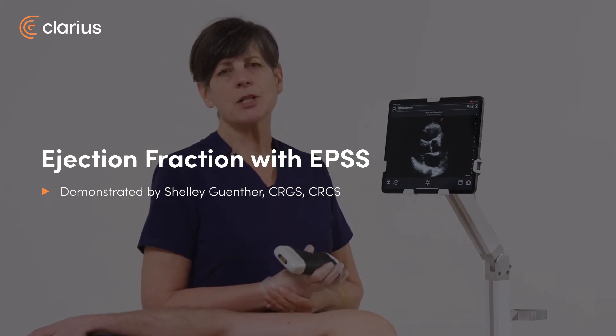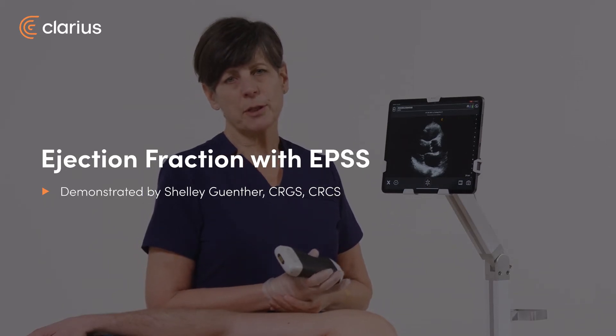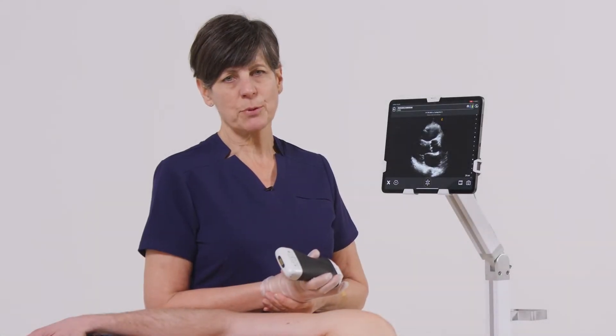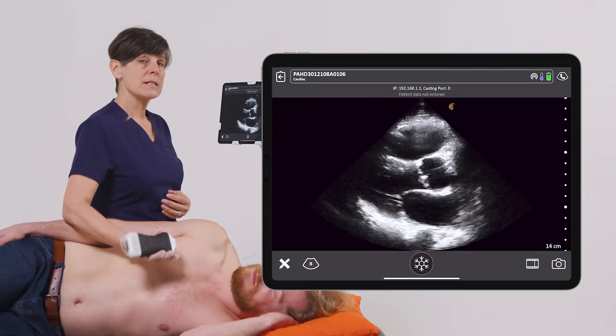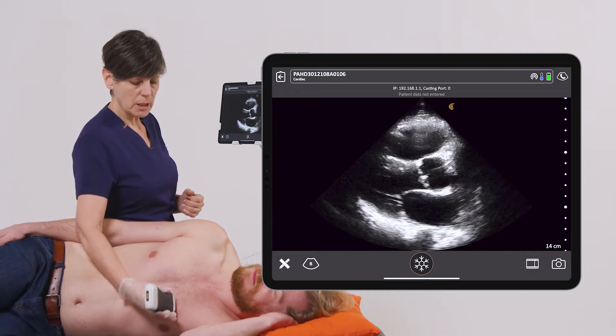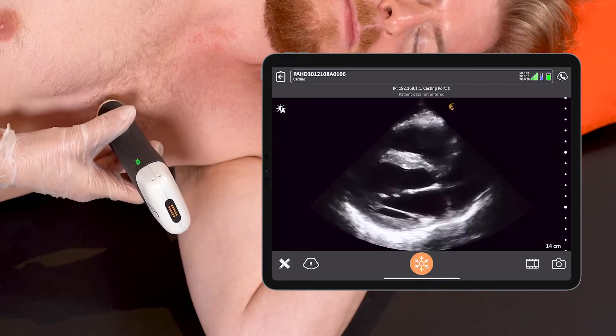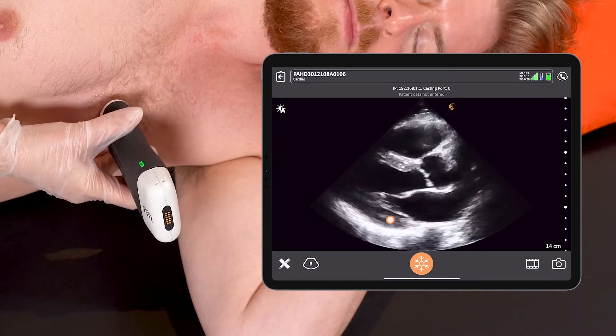Hi, my name is Shelley, and today I'm going to show you how to get a quick left ventricular ejection fraction estimate using the E-point septal separation measurement. To do this, I'm using the PA scanner in the cardiac preset. I'm going to get a parasternal long axis view of the heart, in particular the mitral valve.